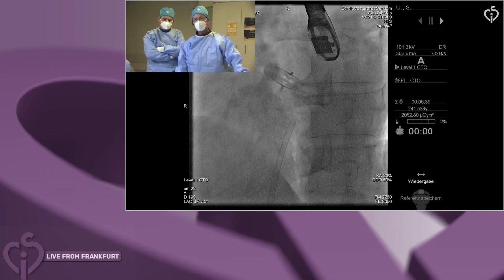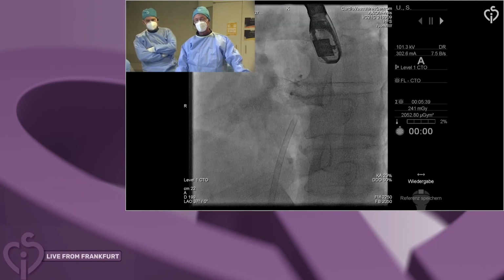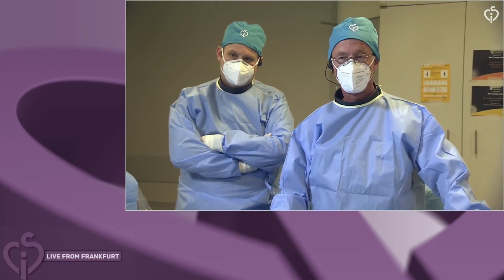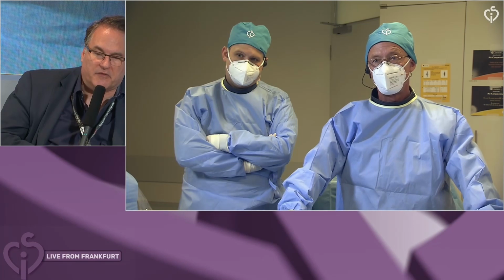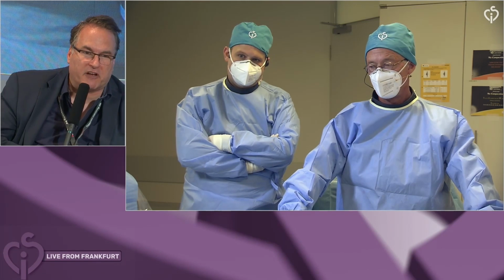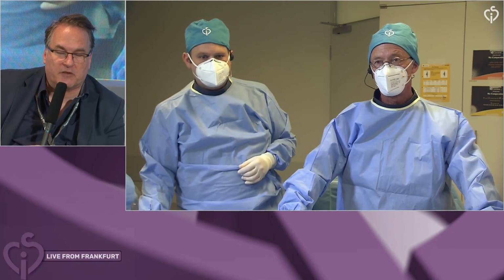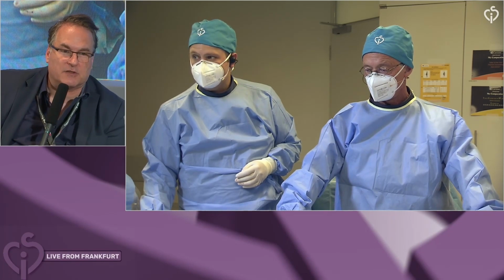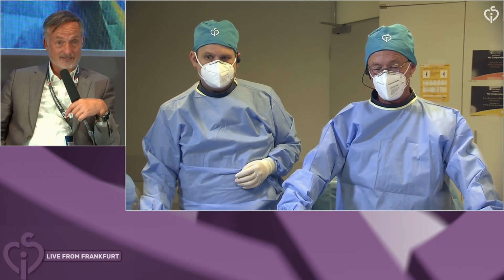Yeah, but in most cases, you can often puncture posterior, and you will compress the device during the procedure, and you can go across with a sheath, and actually the system will then go back into its initial position. So we have done a number of cases where we punctured on the posterior side of the device, and we were able to do procedures with a 22, 24, 25 French sheath next to an occluder. So it goes for smaller devices, and we've also punctured with some electricity through also Gore devices. Also, this is possible. So we do not yet have the ideal device, and this is one of the reasons.